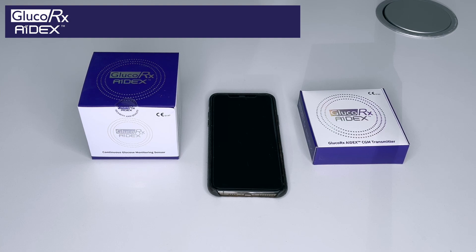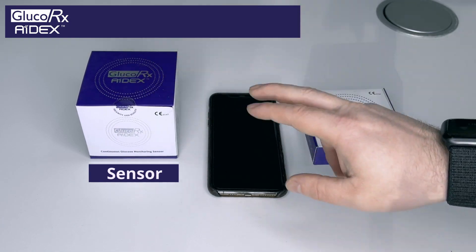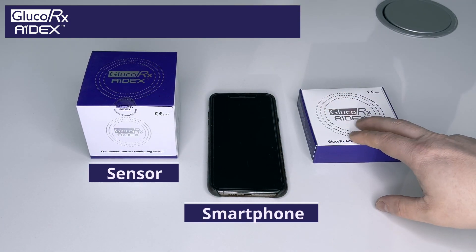At the end of the 14 days you simply change the sensor, pop back on the transmitter and then you continue. So what do you need to be able to utilise this? You need a sensor, a smartphone and a transmitter.